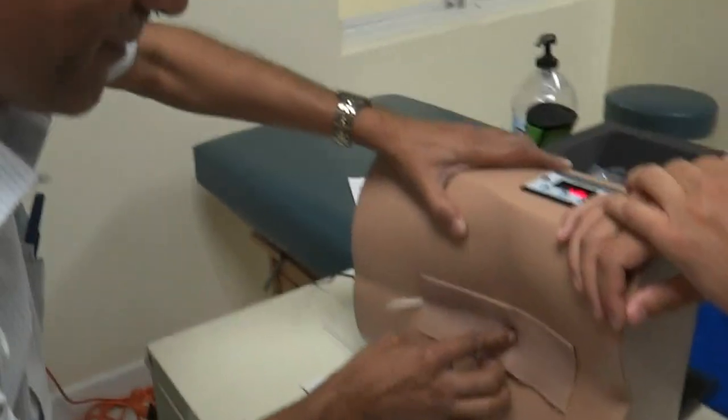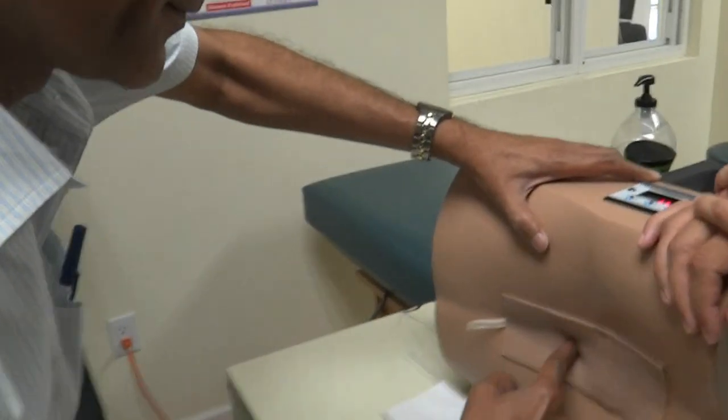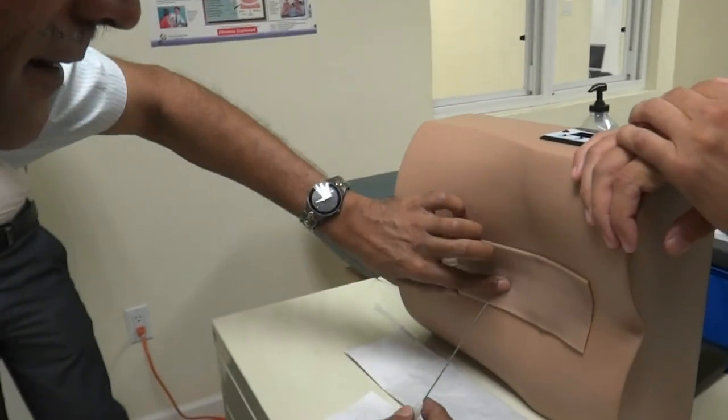This is Dr. Sanyo, trying to go through L203. This one, right? Let me see where it is.